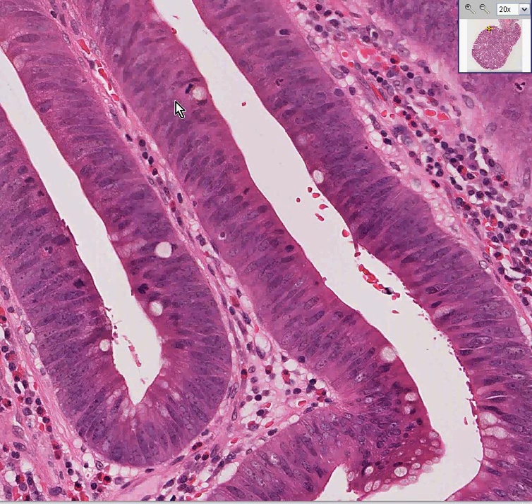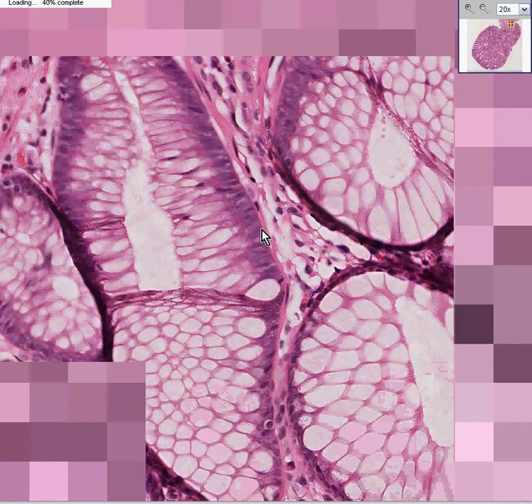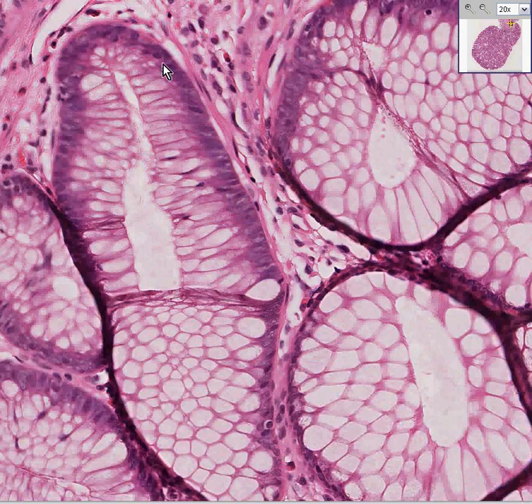tumor. Also notice, I hope, that the overall staining properties of these nuclei are a little bit darker and a little bit more irregular than you see, for example, in the nuclei of the normal mucosa, which are nicely here right at the base and very nicely delineated from the underlying muscularis mucosa. Thank you very much.